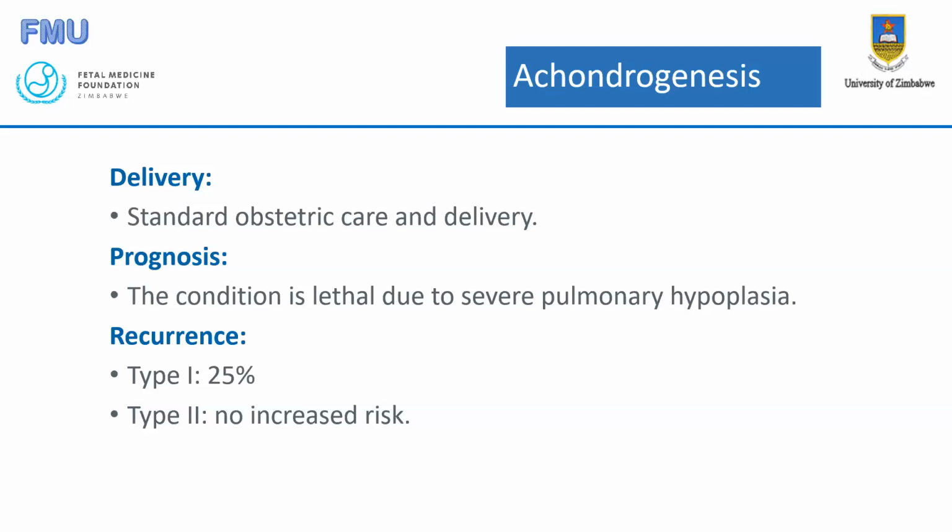And the best time to diagnose the condition is not at the 11 to 13 week scan. Of course, at the 11 to 13 week scan, we may see an increased nuchal translucency. It's neither at the 20-week anomaly scan. At the 20-week anomaly scan, what you may encounter are borderline short bones, those bones which are around the 10th centile, and they are not going to cause the woman to panic because most babies with these borderline bones turn out to be normal.